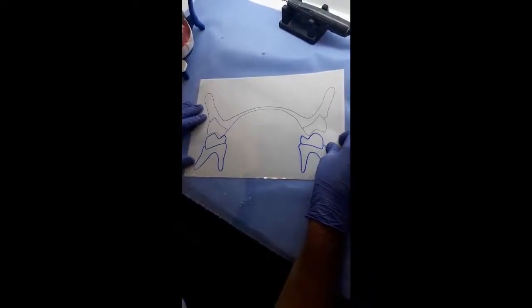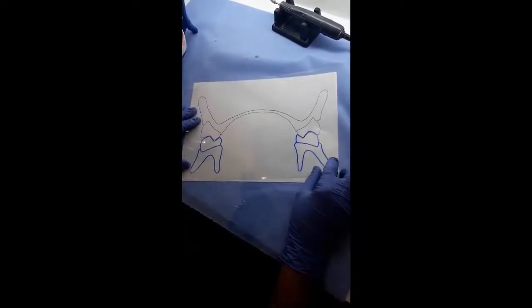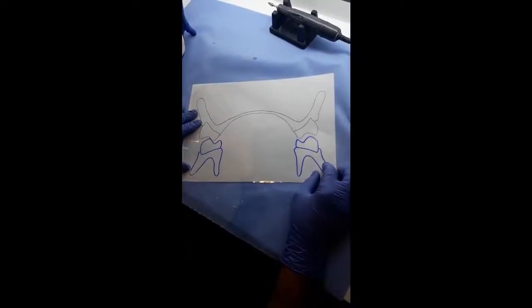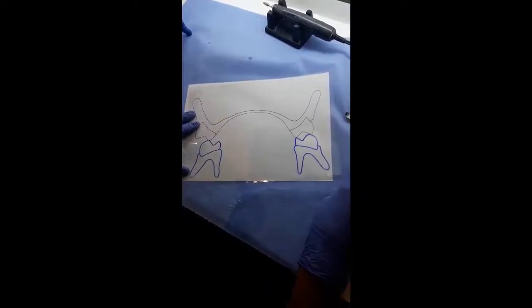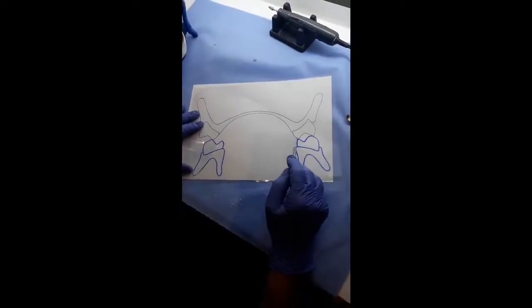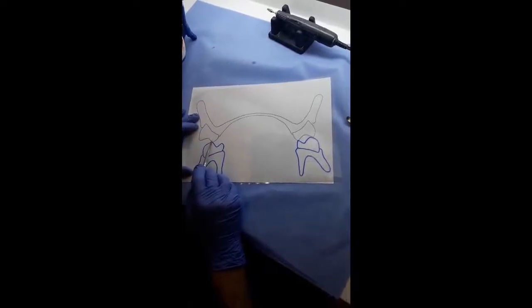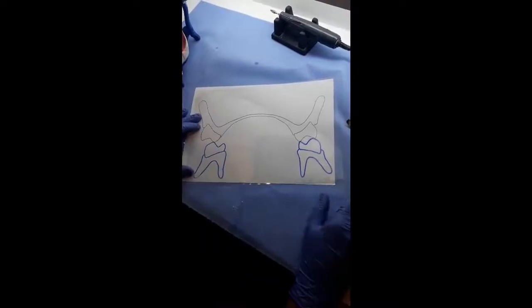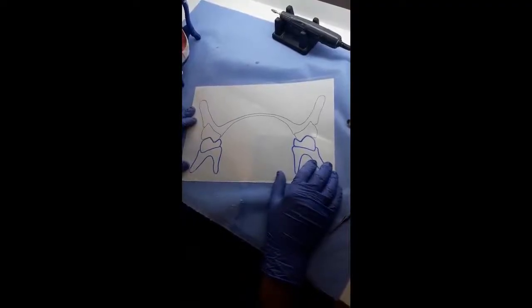Now, when the mandible occludes in the centric again, if the patient moves the mandible to the left side, we'll have the working contact now in this side between the maxillary buccal and mandibular buccal, maxillary palatal and mandibular lingual, and we have a balancing contact here. It's important to stabilize the denture during the eccentric movement. Okay, now the mandible will move back to its centric relation.